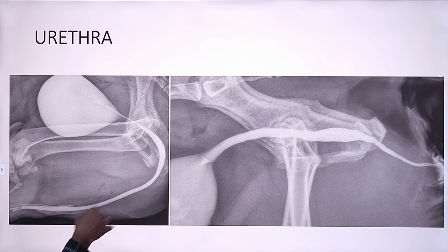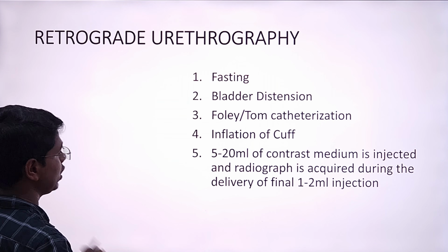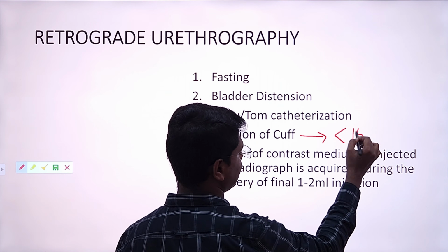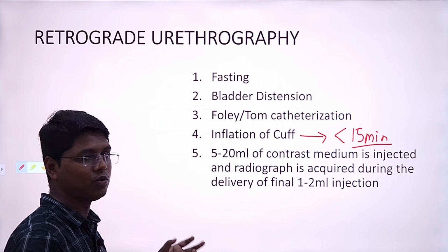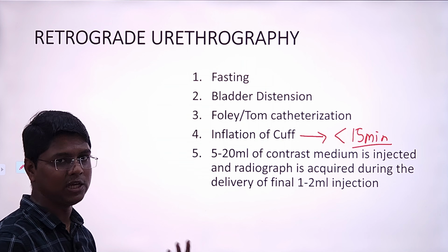Then you have to push the contrast agent. The cuff inflation should not be more than 15 minutes, it should be less than 15 minutes, because if you do it for a much longer time, there might be some damage to the urethra.